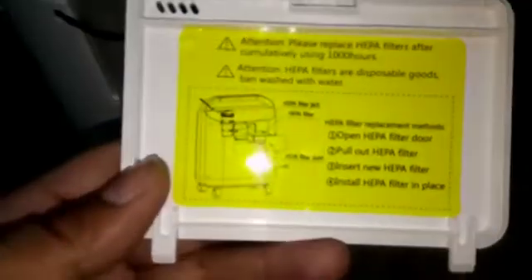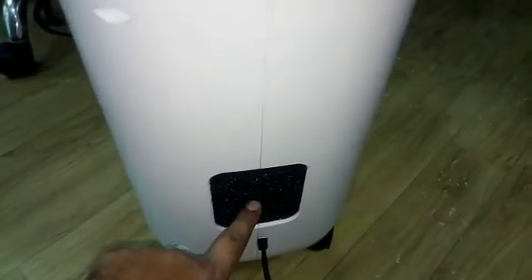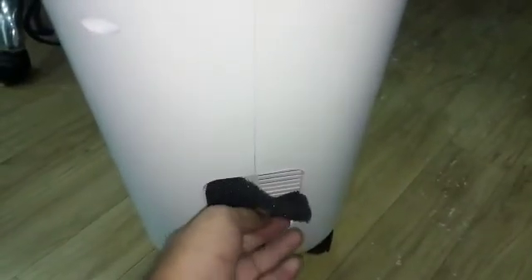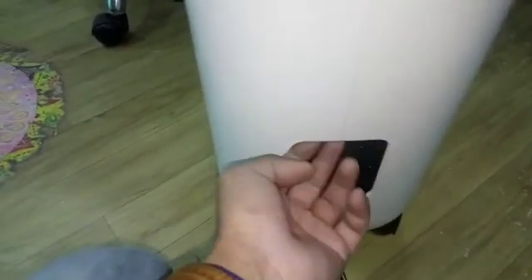This filter is replaced every one thousand hours. This filter is also replaced every one thousand hours, and washed every one hundred hours. Use only a dry filter.